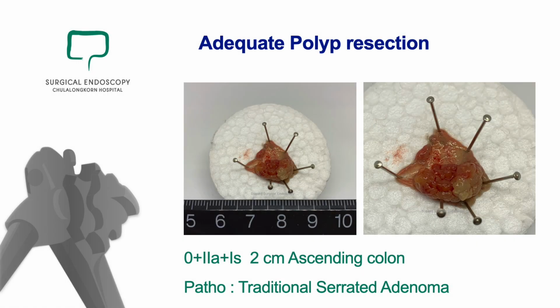Pathologic study reports traditional serrated adenoma. In this lesion, NBI as an IEE helps us to achieve adequate polyp resection.